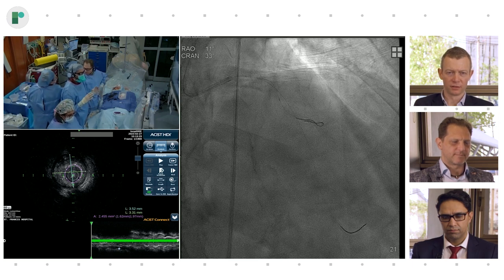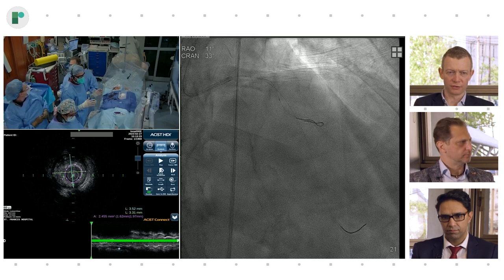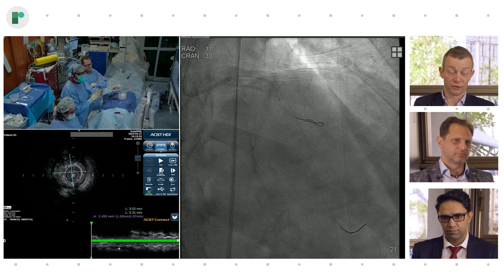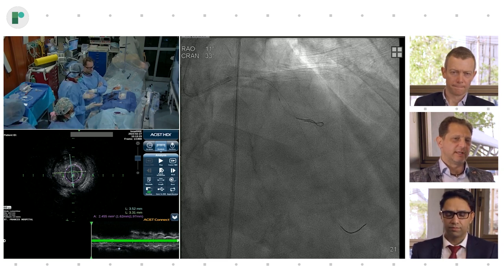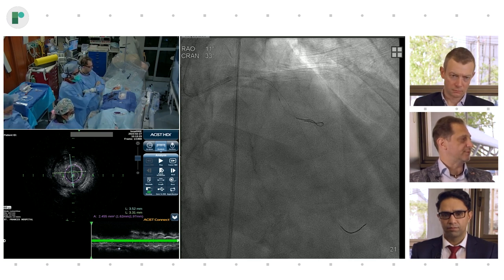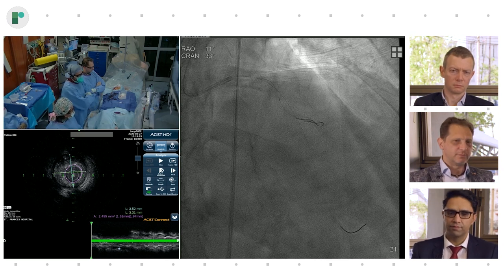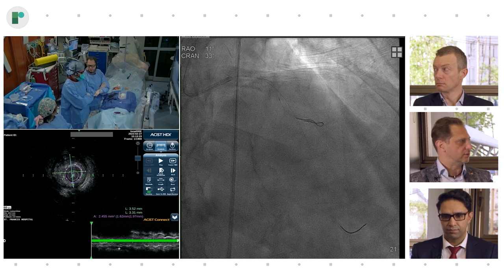Lumen, vessel, diffuse disease. So you clearly did not opt to size on the vessel wall, which is also not precisely measured here because you simply don't see the vessel wall because of the disease and perhaps a little bit of calcium. Yeah, I think the strategy in a case like this, as I mentioned before, is to go by the distal lumen size, you upsize to the next available stent, so maybe in this case a 2.25. But then, of course, make sure proximally it's probably a 3.5 vessel that the 2.25 can actually be dilated to 3.5.